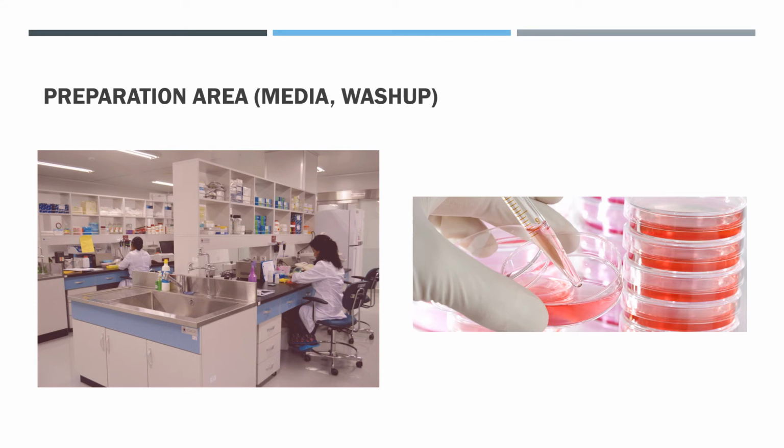Then also, space is required for wash-up. The need for an extensive wash-up is minimized if disposable plastics are used, but there will still be a need for some glassware washing, as well as handling and disposal of used plastics, which may need to be autoclaved.